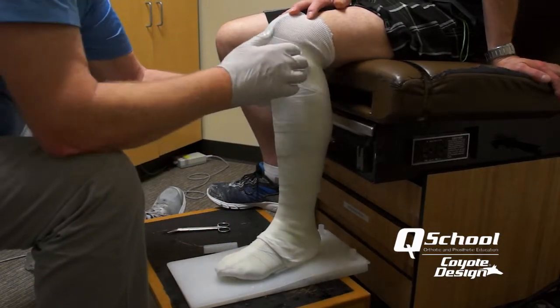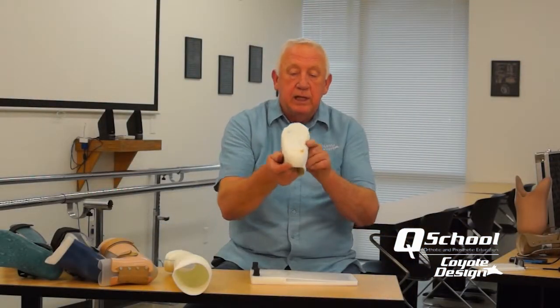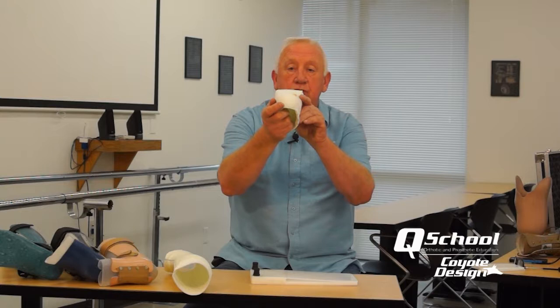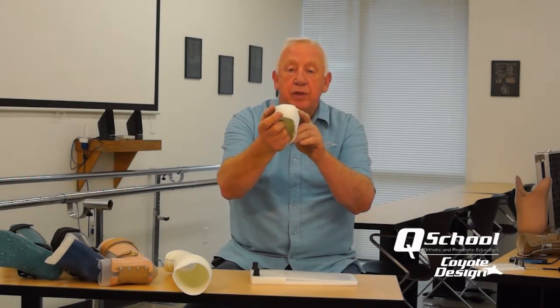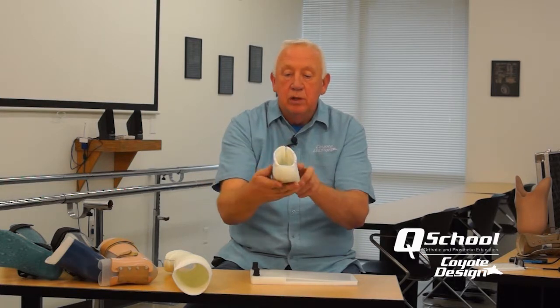The practitioner does her evaluation, sets it up, and does the casting. We end up with a really nice flat surface that's going to mate with the inside of the shoe and give good medial-lateral stability, so the bottom is not rounded and won't contribute to ML instability.